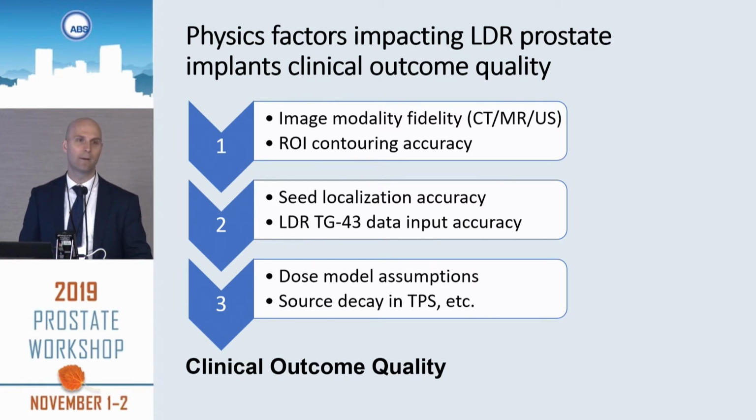These are really common sense, and so I'm just mentioning them offhand so that you don't think that this might not be an essential component. And finally, that you have dose model assumptions. If you use the wrong dose model or the wrong half-life in that procedure, or you selected the wrong isotope, if you're a center that uses multiple isotopes, then you're going to have a problem with the quality of your implant.